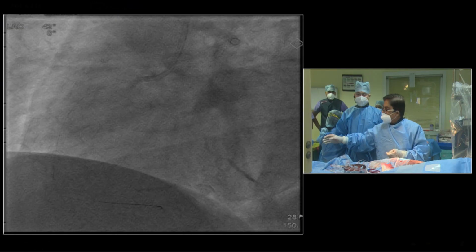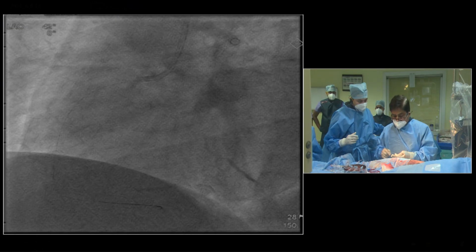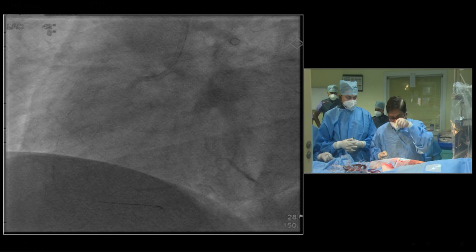And not only for success, it's also important for patient safety, I think. It is important to understand the capacity of using 10 balloons in a case. 10 balloons, 12 wires. But I'll use them.